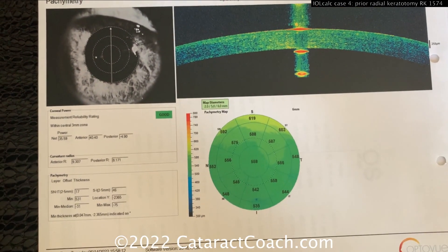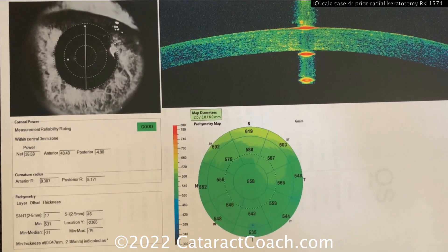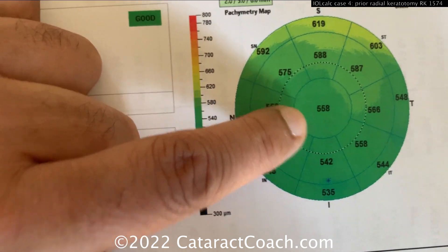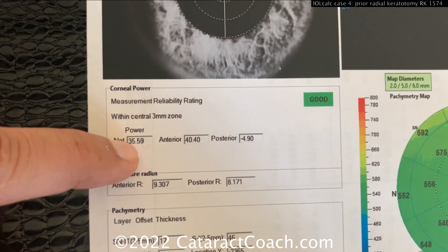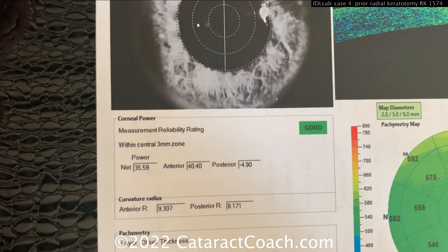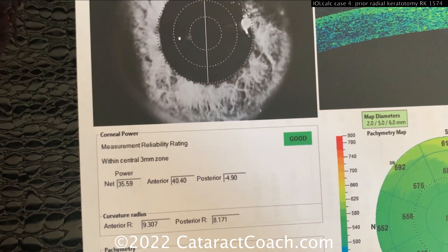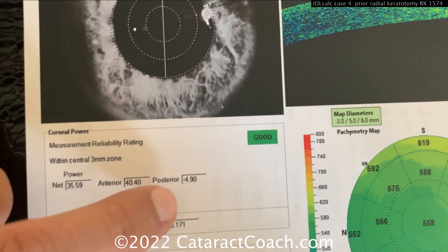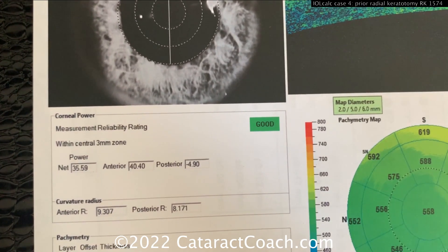This is an OCT image of the cornea for that same left eye. Pachymetry is normal — we didn't change the thickness of the cornea, but the curvature did change. The net power is 35.59, with an anterior power of 40 and a posterior of minus 4.9 diopters. That minus 4.9 on the posterior surface is different from LASIK, where you only change anterior curvature and the posterior is typically about minus 6 diopters. Here it's less because RK changes both anterior and posterior curvature.